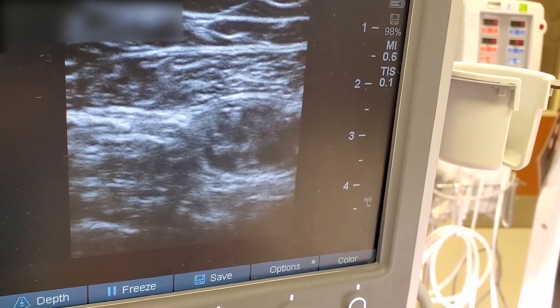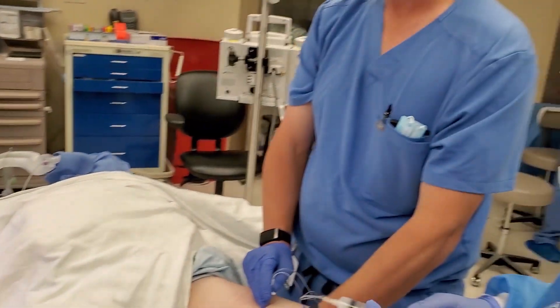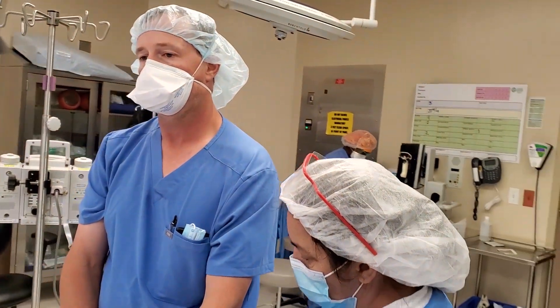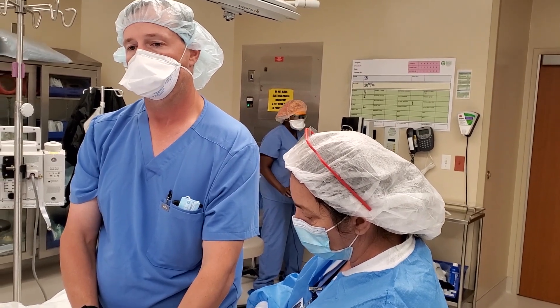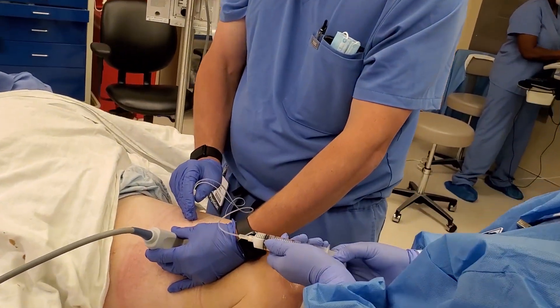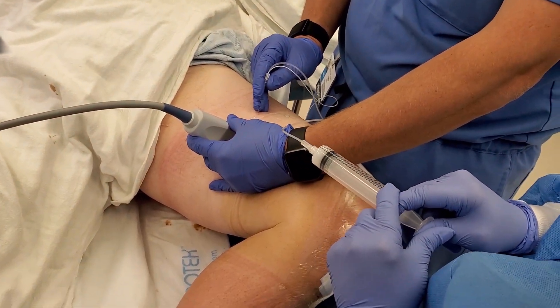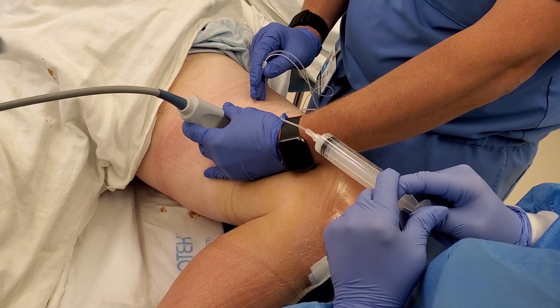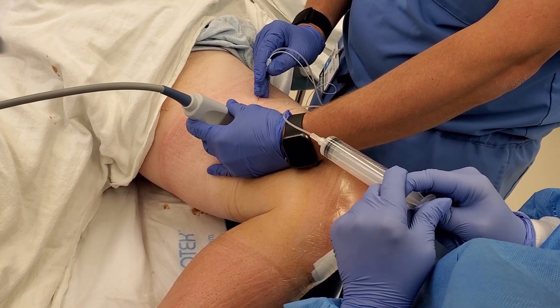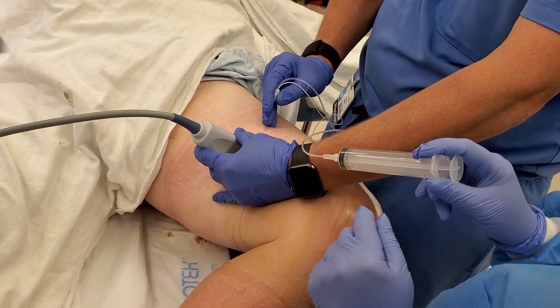What I like to do is inject 15 cc's into the canal, and then save the last five cc's to come out slightly, still deep to the sartorius muscle, and inject the last five just in case the nerve to vastus has split off.